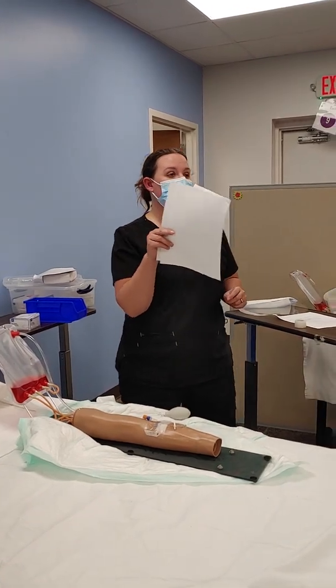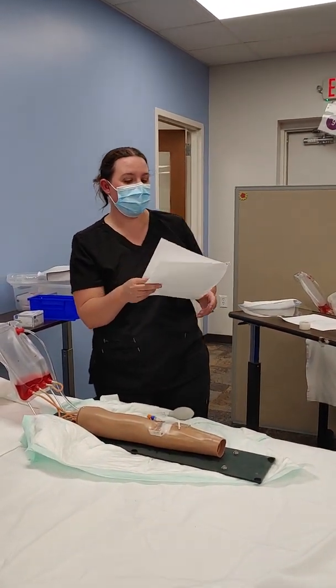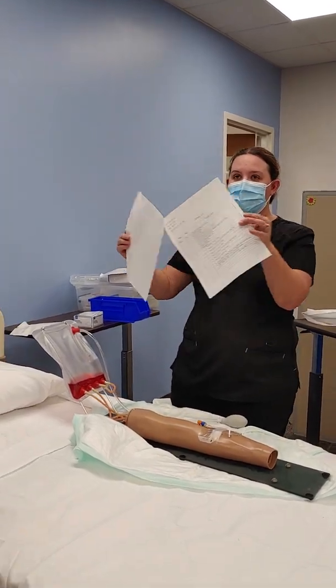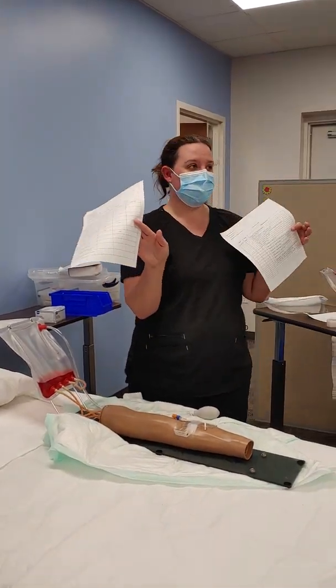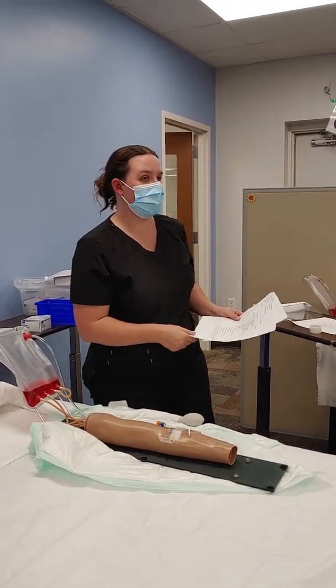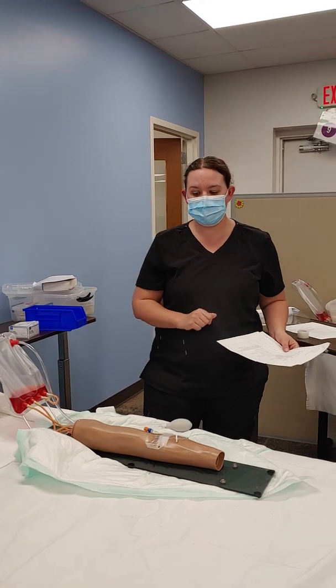So we are doing IV push. Okay? So you're going to get a MAR. It's got a physician's order and a MAR sheet. Okay? I'm going to tell you your patient is Martha Smith. I want you to give her IV furosemide. We'll go ahead and start the competency.